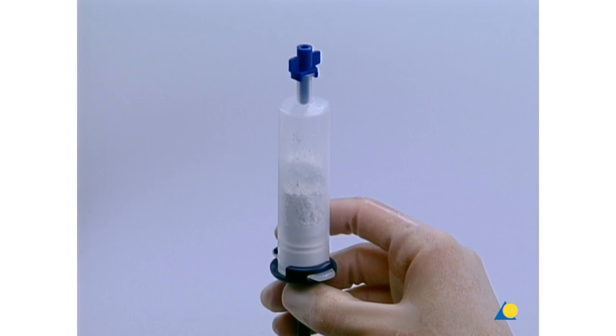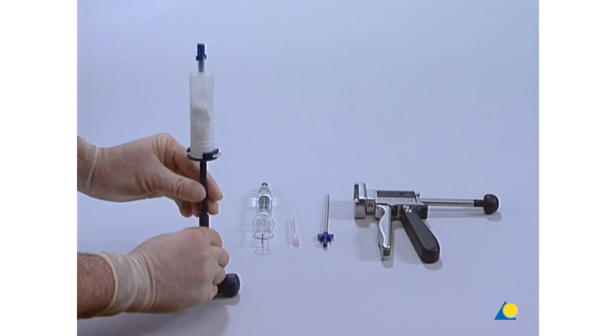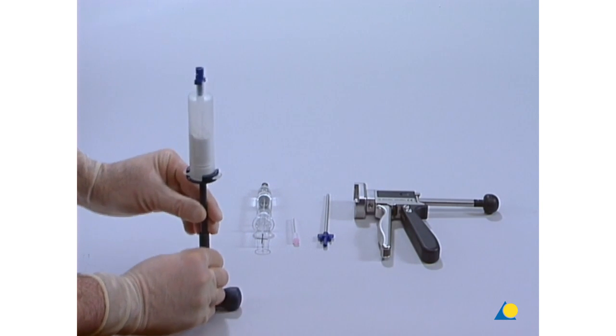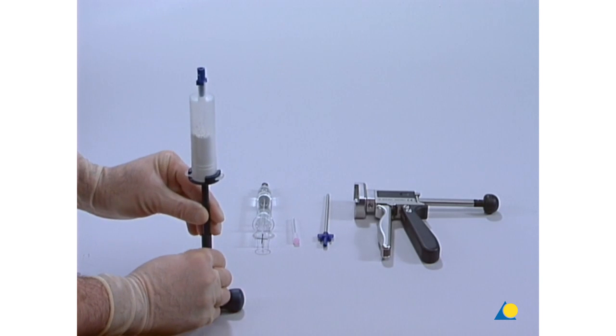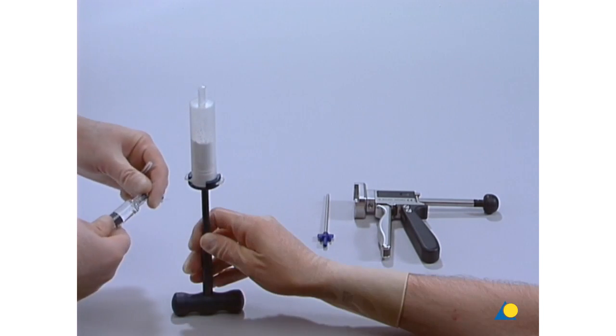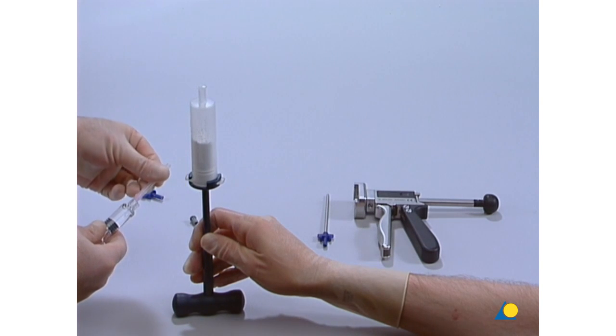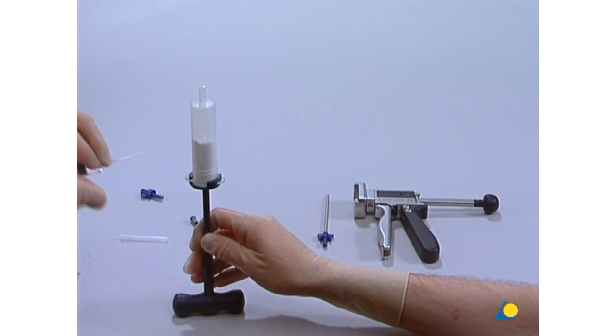The Kronos inject powder is supplied in an application cartridge. Tapping the application cartridge is necessary to make the powder fall into the base of the cartridge. The blue sealing cap is removed. The blunt injection needle is mounted on the syringe containing the liquid component. All the liquid is injected into the cartridge.